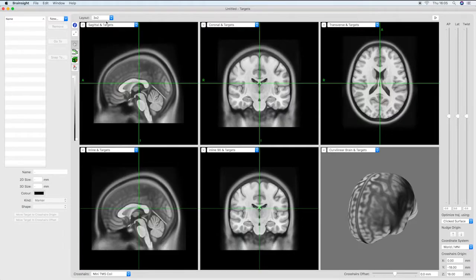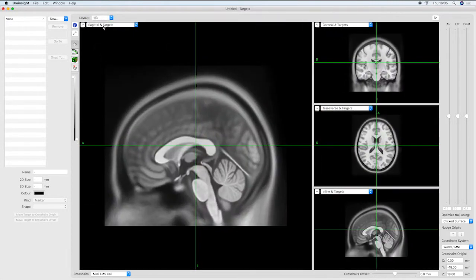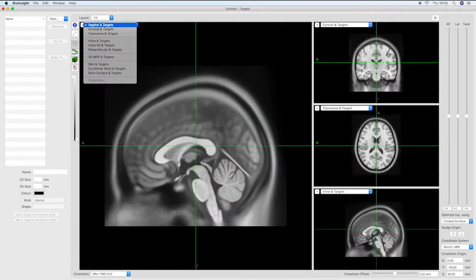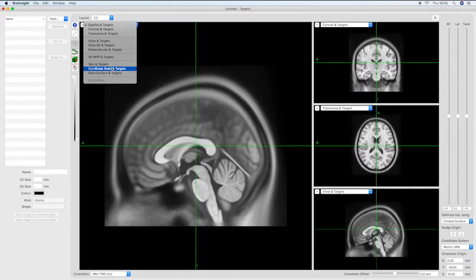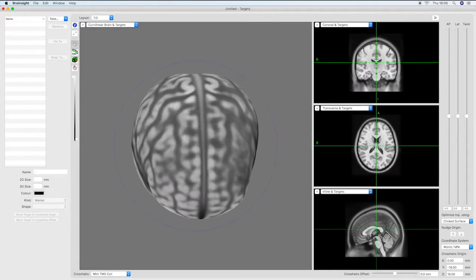This will now give you the option to select a location for your target. You can alter the layout of the images in this screen by clicking here. There is no best layout so choose an option that is most suitable for your site of stimulation. Here a curved linear brain has been selected.